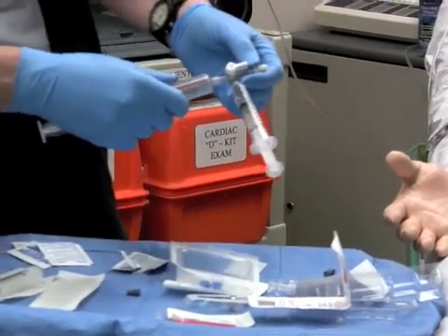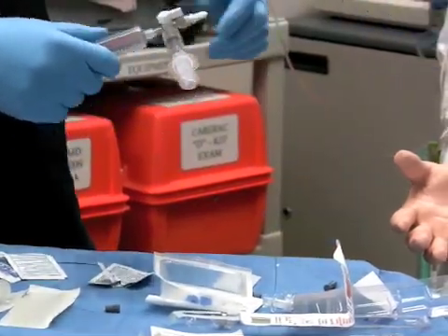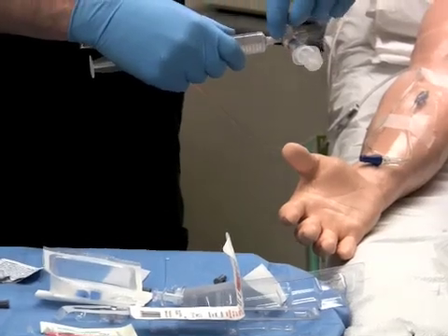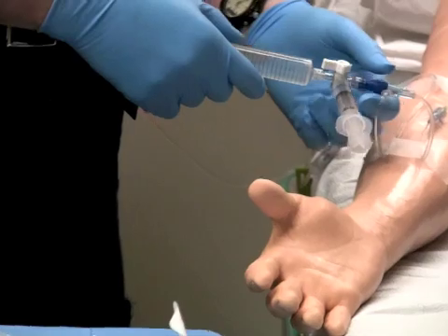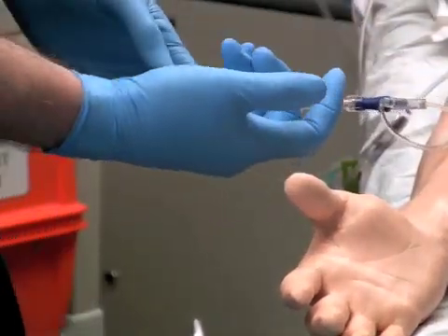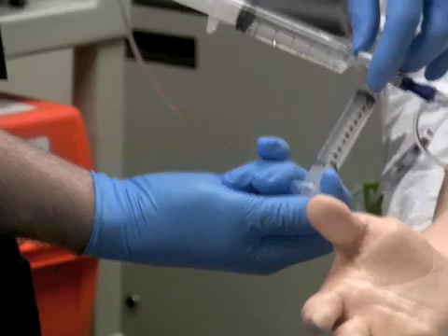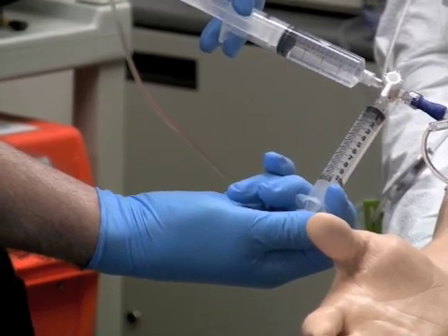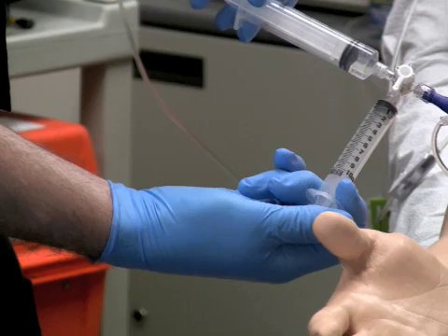Again, reattach our 20cc syringe. We're ready to go for the 12 milligram push in the same manner as we did for the 6 milligram. Again, everything is secure — a little extra common sense in here — and all set. There goes our 12. Switch the lever to the open channel and follow through with your saline flush going directly to the heart. Then just observe to see if you have any change in the rhythm. Reassure your patient and reassess.